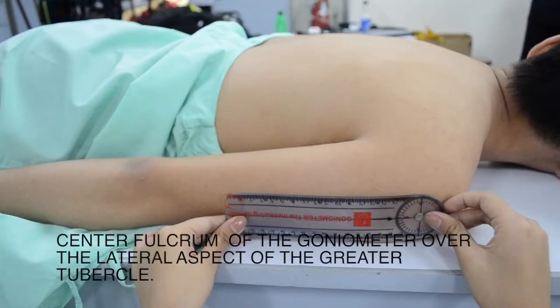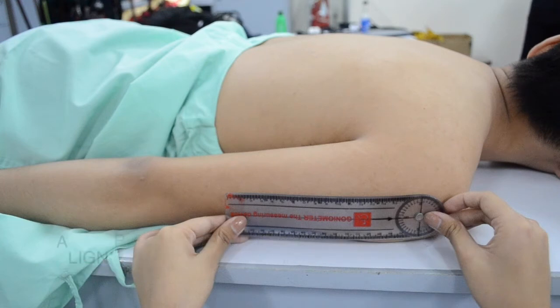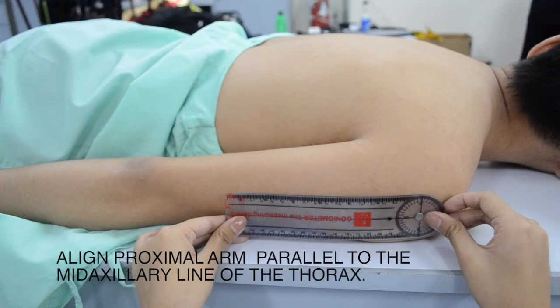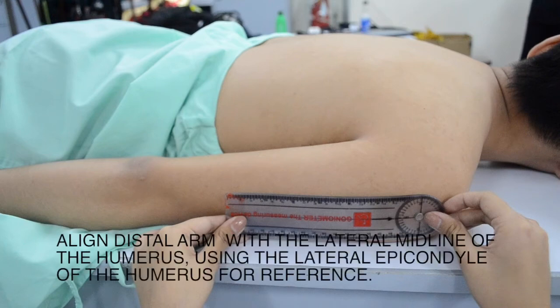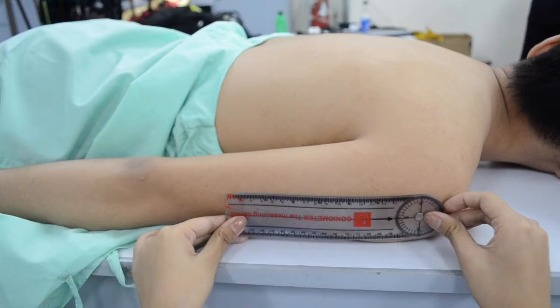Center the fulcrum of the goniometer over the lateral aspect of the greater tubercle. Align the proximal arm parallel to the mid-axillary line of the thorax. Align the distal arm with the lateral midline of the humerus, using the lateral epicondyle of the humerus for reference.